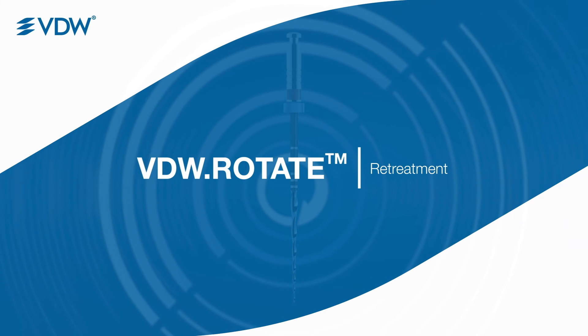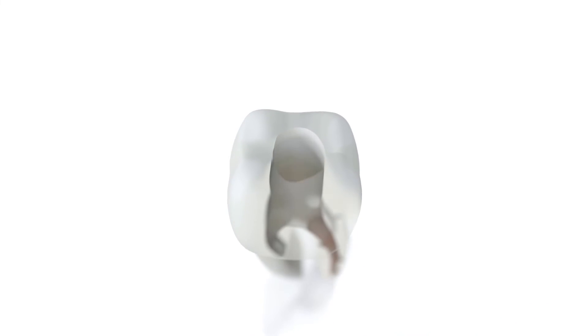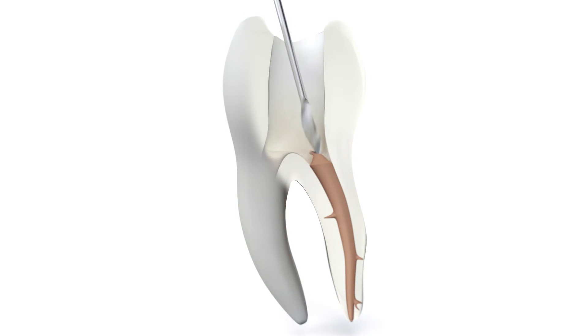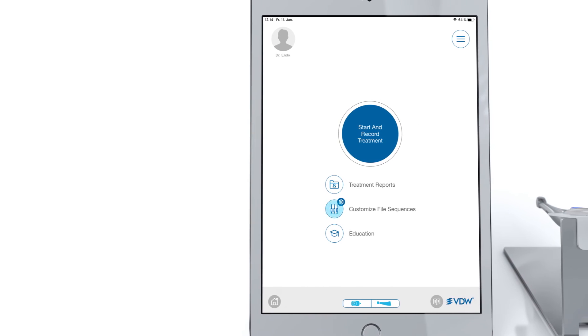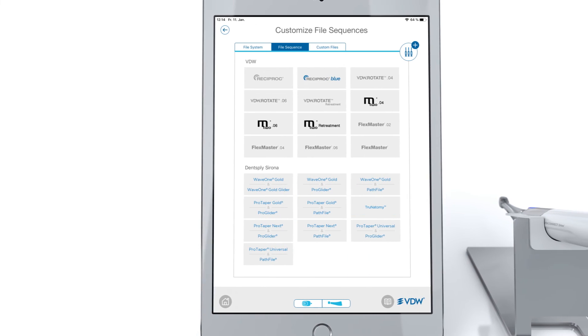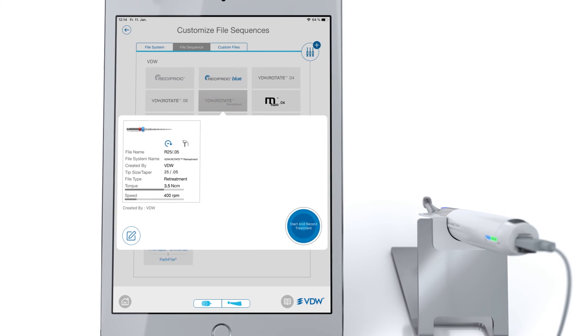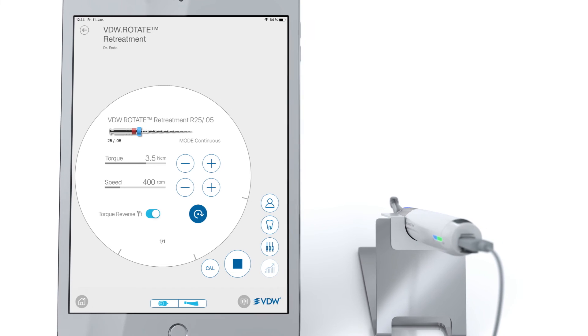For re-treatment with the VDW rotate, open the canal orifice with a Gates Glidden drill or an ultrasound instrument and remove the root canal filling from the coronal third. Choose the appropriate pre-programmed torque-controlled electric motor setting according to the VDW rotate 2505 re-treatment instrument. These settings are already pre-programmed in your VDW connect drive motor.